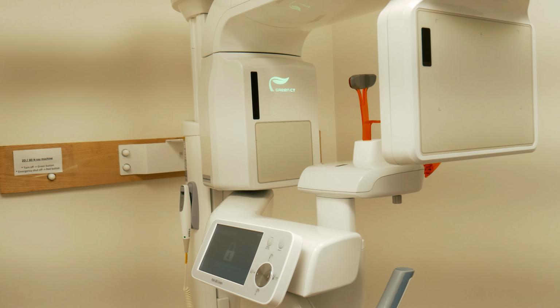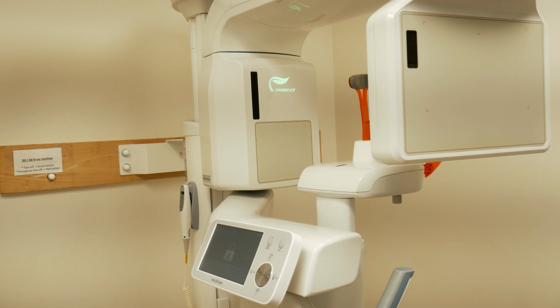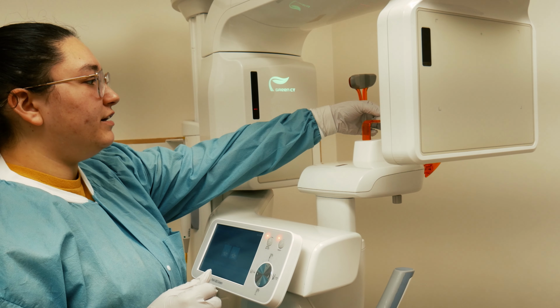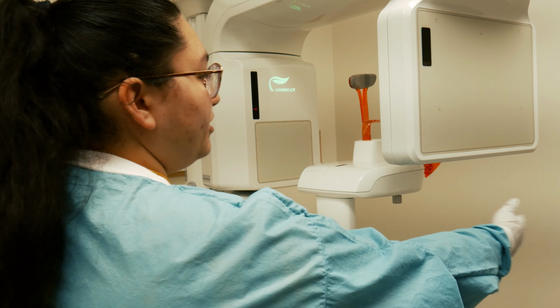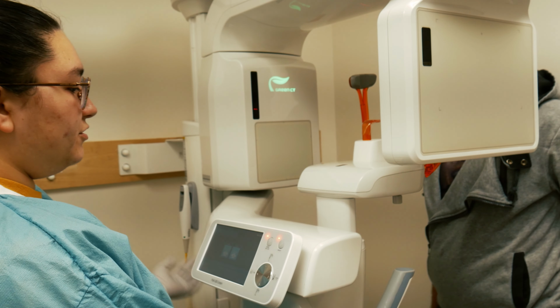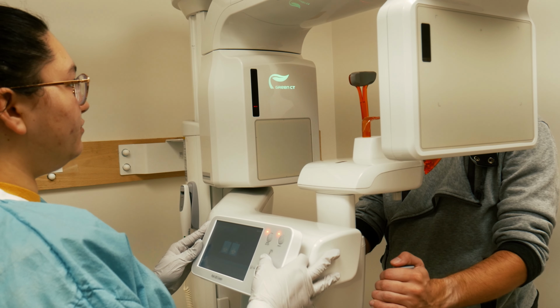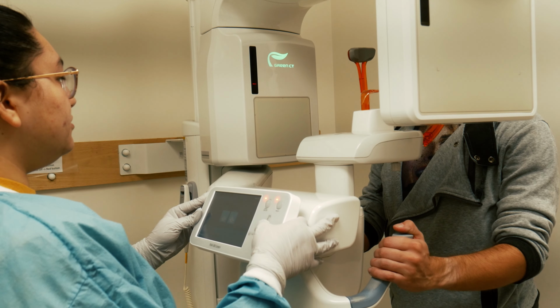Okay, so now we're going to initialize. The system is initializing. Please wait. Okay, and then you want to place your barrier around the piece that the patient will be biting on. Then you have the patient come right over. I'll have you hold on to these handlebars for me. You're going to move the machine up to the patient.